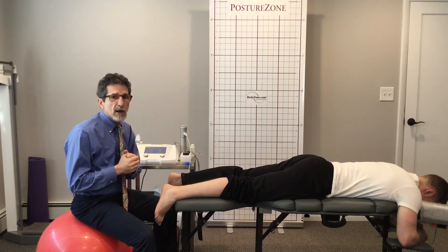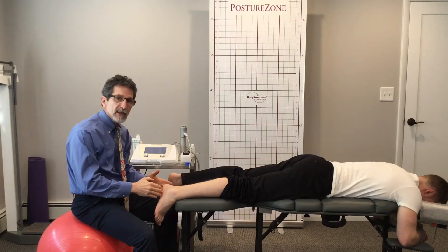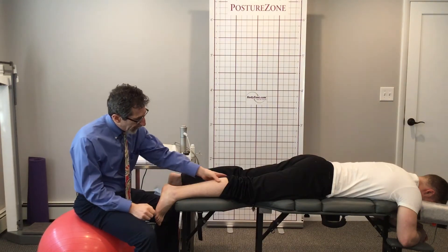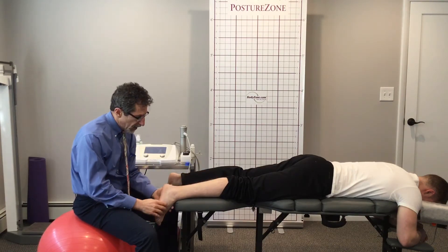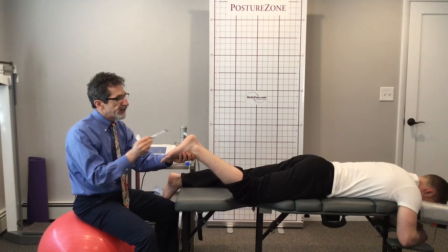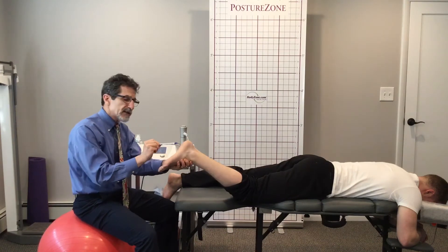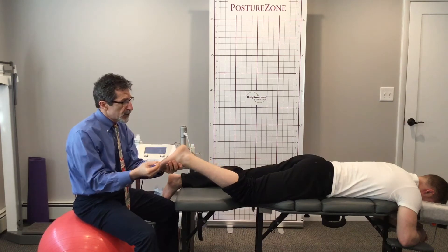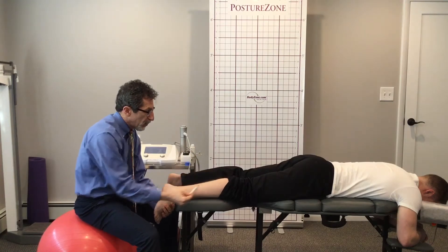Today we're going to talk about radial shockwave therapy as an adjunctive therapy to stimulate healing of the plantar fascia. We know that oftentimes the calves are tight so we still need to release the calves, and oftentimes there's lots of inflammation right on the bottom of the plantar fascia, sometimes along the sides of the heel, sometimes even the ball of the foot. So we want to get the local inflammation down and we still want to lengthen that.